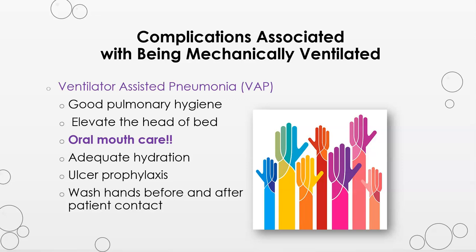Elevate the head of the bed at least 30 degrees at all times. Ensure adequate hydration to keep the secretions loose. And maintain ulcer disease prophylaxis, such as proton pump inhibitors or H2 blockers. It is sad that I have to remind nurses to wash their hands before and after each patient contact.